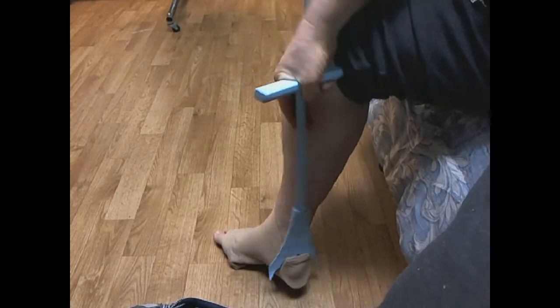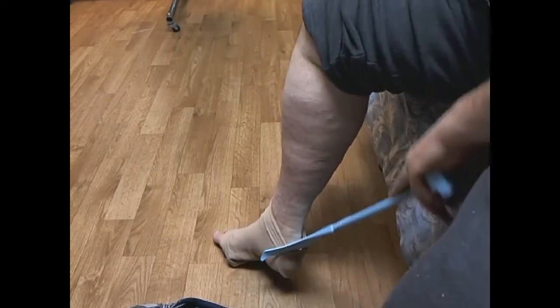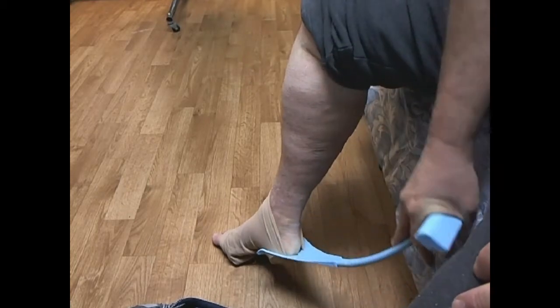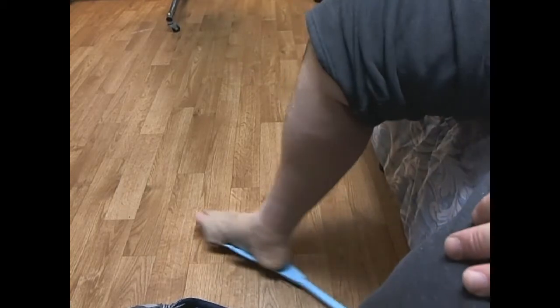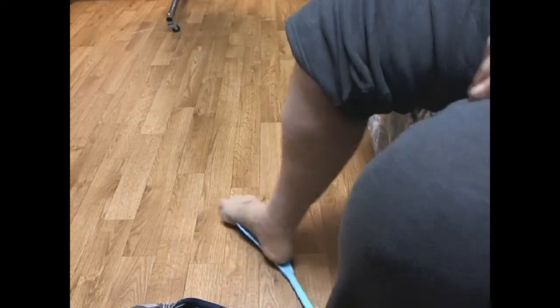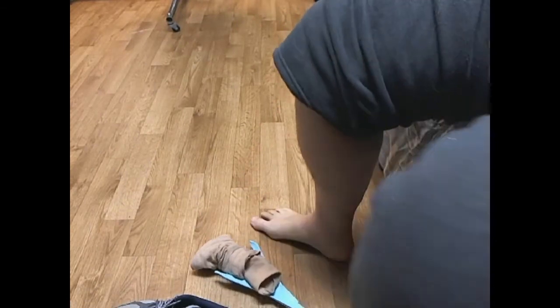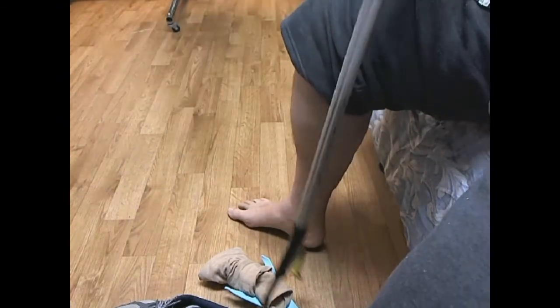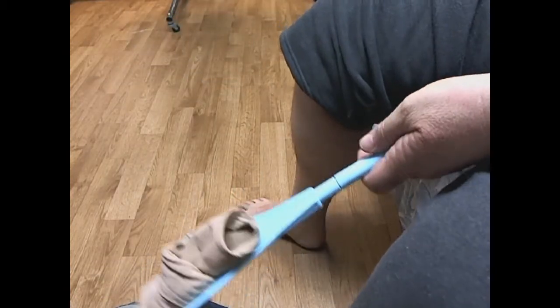Works reasonably well. A lot easier with regular socks. These are pretty hard to come off, but it works. It works, and that's what it's for. There. And of course, it's on the ground. I can't reach it, so I'm using my grabber. Don't bend past 90 degrees.